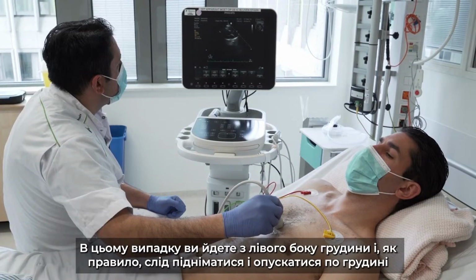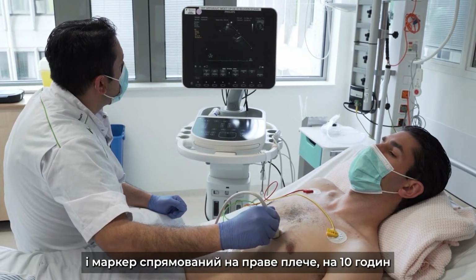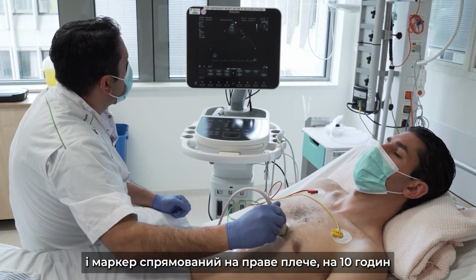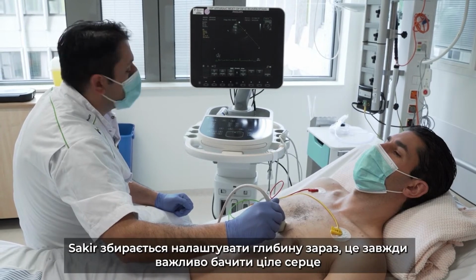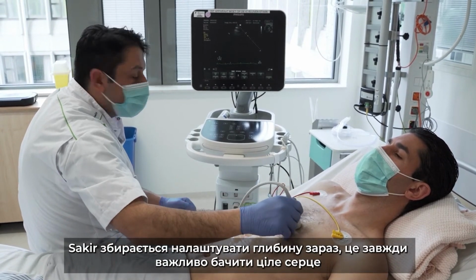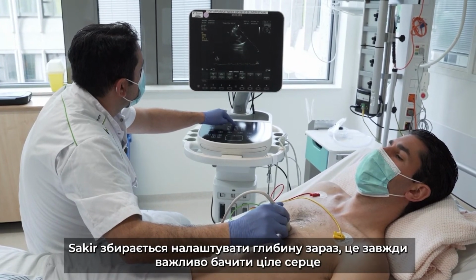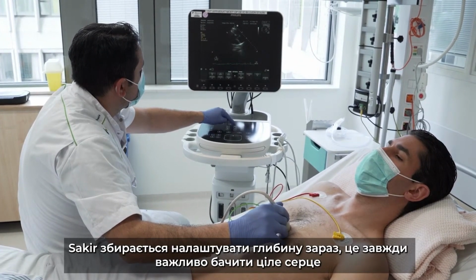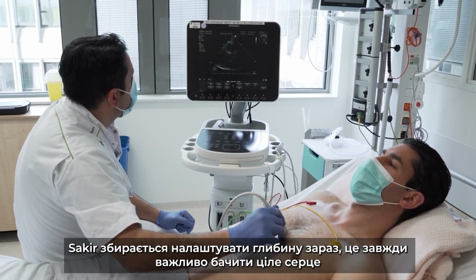Usually you should go up and down the sternum, and the marker is directed to the right shoulder, so that's 10 o'clock. And Sakir is going to adjust the depth now, because in echography it's always important to see the whole heart, the whole image in your window.